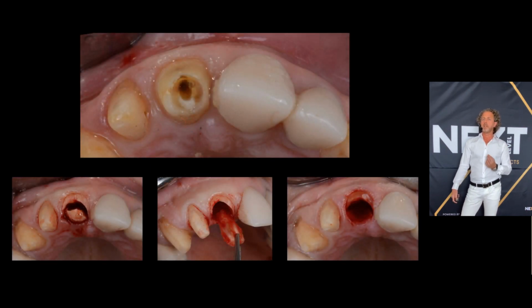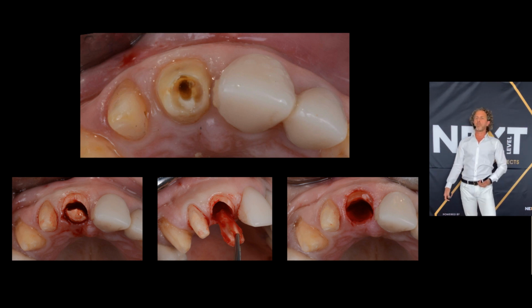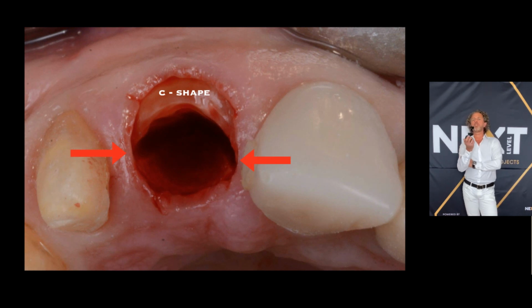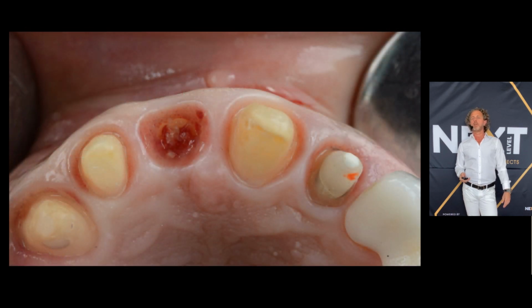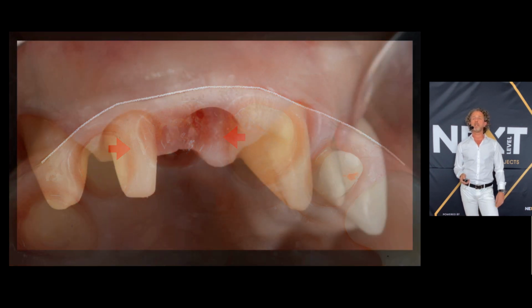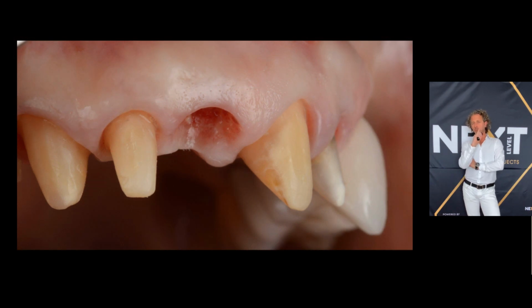So I made my, let's say, socket shield. I started like usual. I removed the palatal portion, but actually it's a C-shaped shield. Why? Because I tried to provide support of my papillae on both sides with this C-shaped shield. And look at how it is. It's amazing. No tissue loss buccally. We have very nice papillae on both sides. And this is the tissue profile.